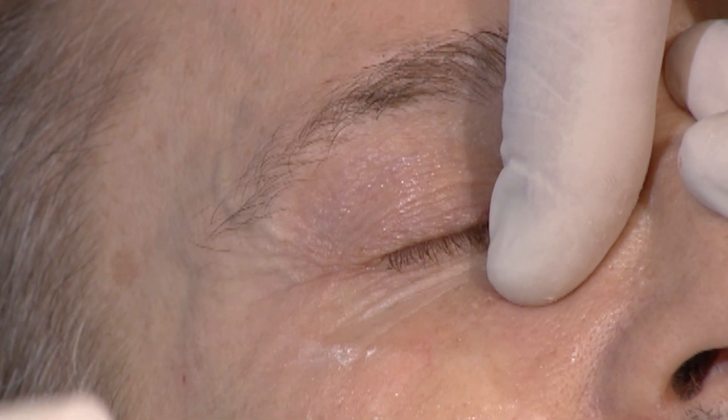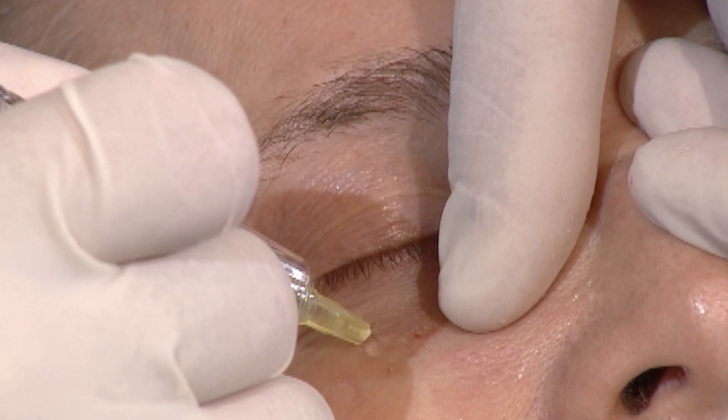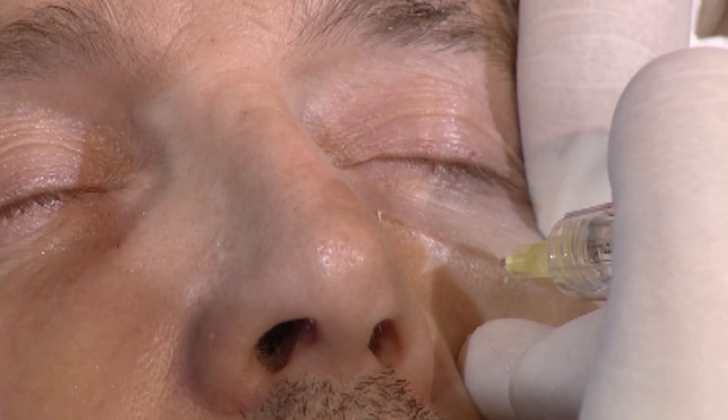I talked about it with Thierry before — he wanted to be injected laterally, and I do it. So you see, it's very quick, very simple, no pain. You feel the bone and you inject.